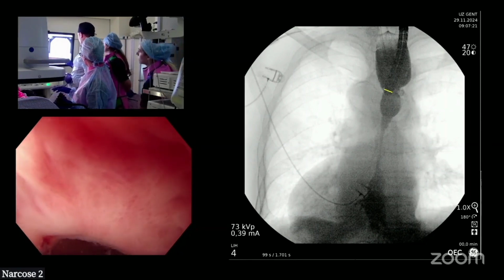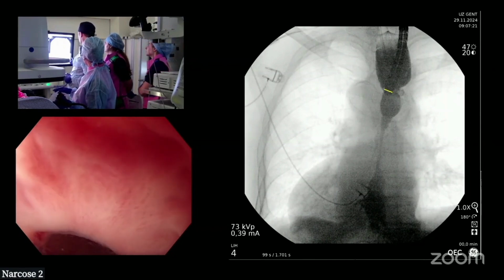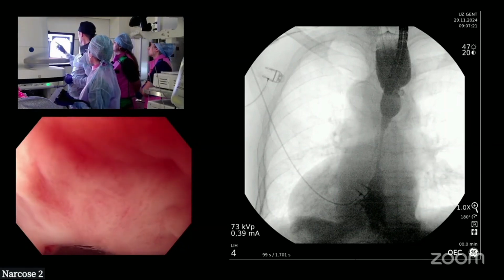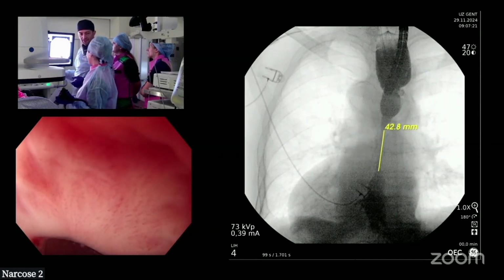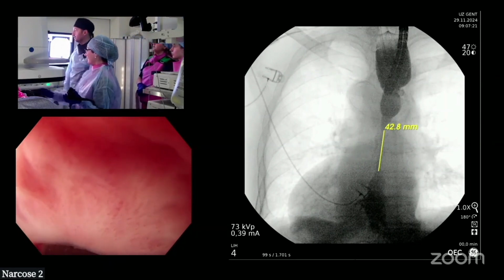Nice. Yeah, nice. 9.1 millimeters. Okay, if we close this now, then we can go okay, and then we can try to measure it here. All right, so then we have got the idea. Oopsie, not too bad, eh? Yeah. Pretty good. Okay, so we know how long it is.